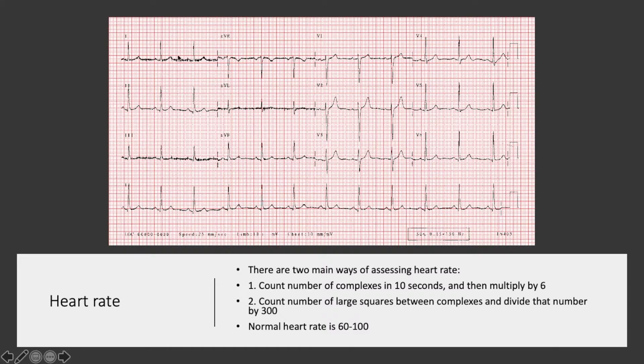If you look at the ECG strip you can see that there's a bunch of different numbers and letters across it — for example we've got 1, 2, 3, V1, V2, V3.